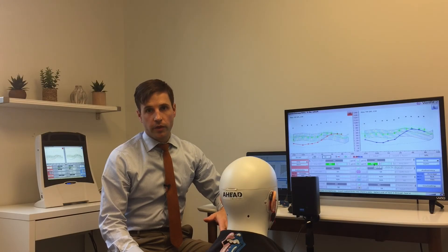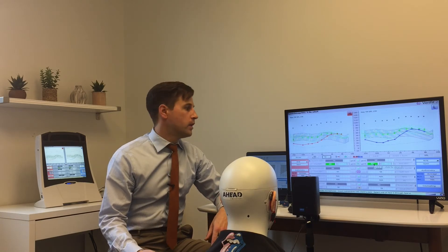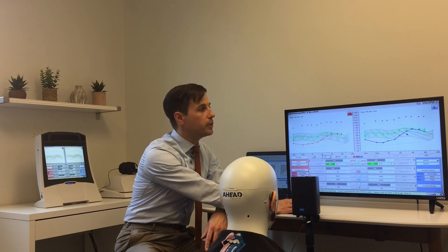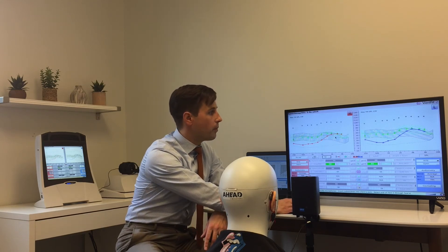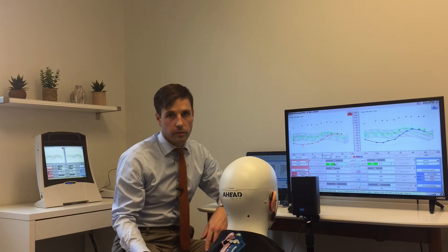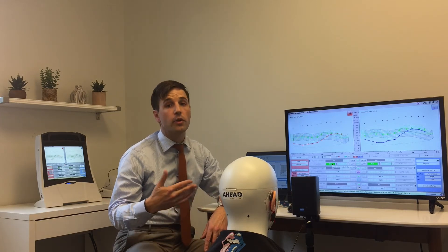What I love about the Verifit and speech map is that it's really a way to help the client understand how their hearing aids help them and why they're wearing hearing aids. I would probably tell the patient: 'Carl, you can see that this gray area that falls beneath the red and blue lines is the information that you are missing. Now that we've amplified, you can see that a lot more of that is falling above the red and blue lines, meaning it's audible to you.' Patients love to get percentages about their hearing, so I'd tell him his unaided percentage, his aided percentage, and that the difference is going to be noticeable for him.